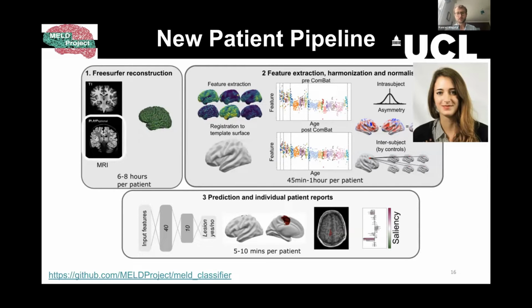So that process is trying to learn maybe your FLAIR, your temporal lobe FLAIR, it looks lower than our average, and we'll adjust for that. It then carries out the normalization steps, and then finally runs this prediction based on the input features. Does each patch of cortex look like lesion, yes or no? And wrap that into the clustered output. This is where we think the clusters are. This is where they are on the original T1 MRI. And this is a report for each cluster saying which features were abnormal and how important that was to the classifier.